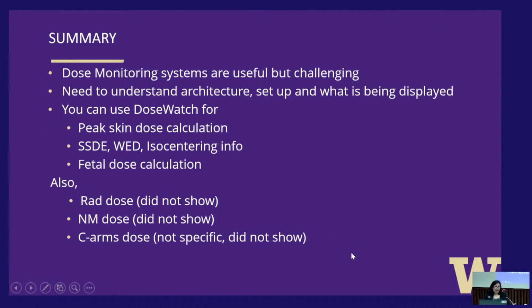So in summary, all I was trying to give you was a little flavor of how you can use these dose monitoring systems, because all we have talked about is CT, but there is a lot more out there that you can use it for. So dose monitoring systems, they're useful, but they're challenging. You cannot just buy it, plug it in, and you're done.